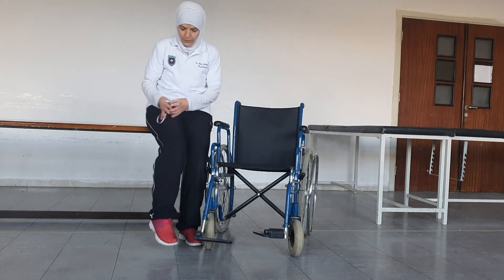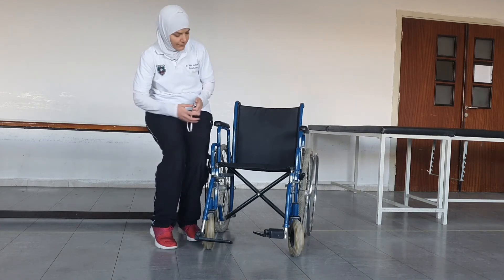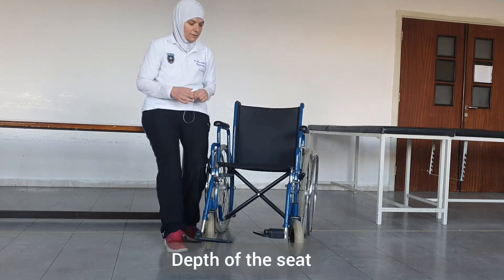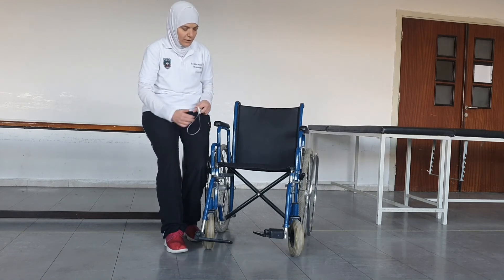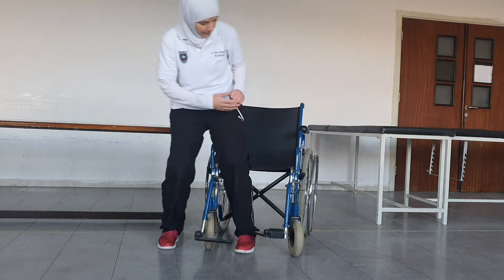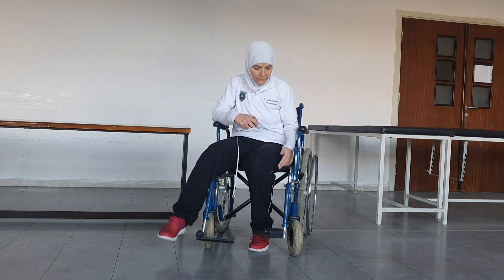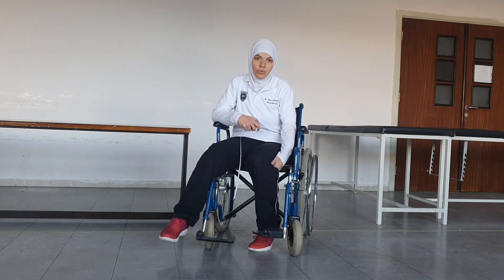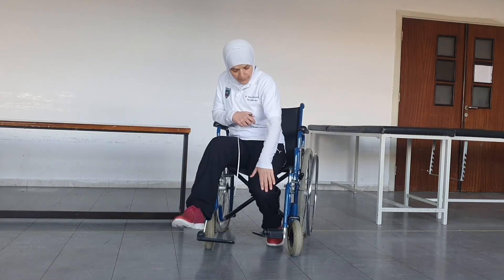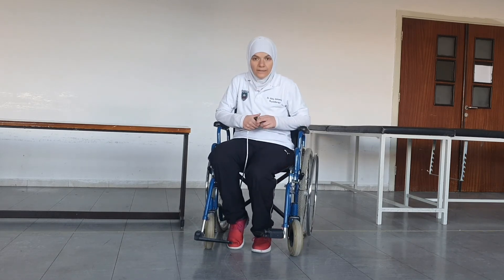The third measurement is the thigh length, measured from the back of the buttocks to the back of the knee. This corresponds to the seat depth of the chair. If the seat is too long, the front edge will rub against the back of the knee, potentially causing a pressure injury. If the seat is too short, the patient's feet will dangle, resulting in uneven pressure distribution.